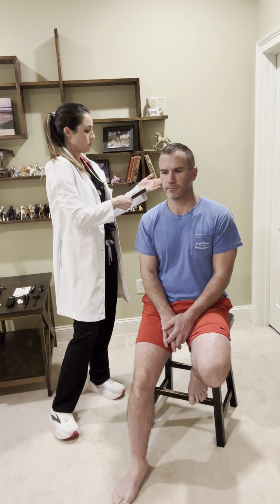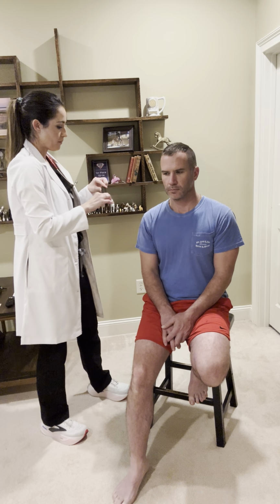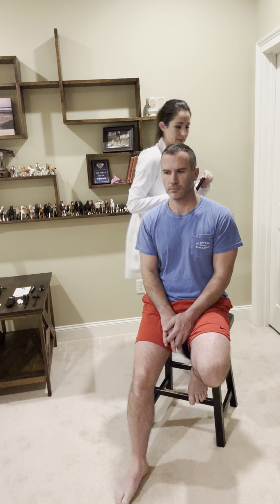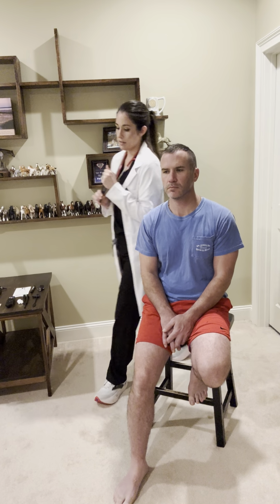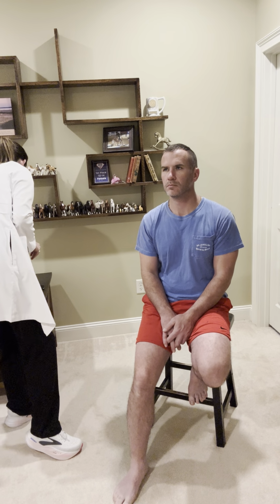This will be with the tuning fork. Tell me if you hear this equally on both sides. Yes. Okay. Then the third test is going to be the Rinne test. So tell me when you stop hearing this. Now. Do you still hear it? Yes. Okay. Same. Now. You still hear it? Yes. Okay. That lets us know that air conduction is greater than bone conduction.